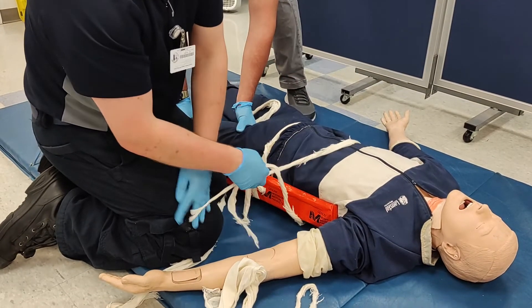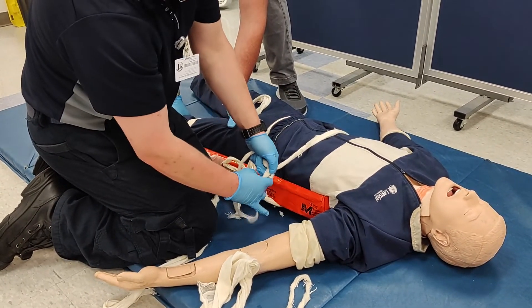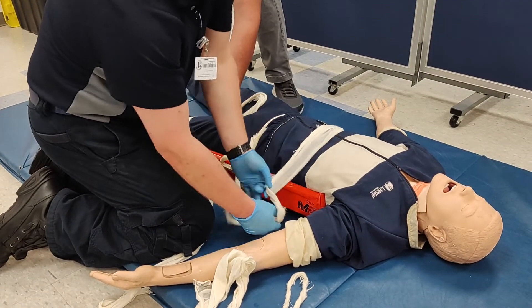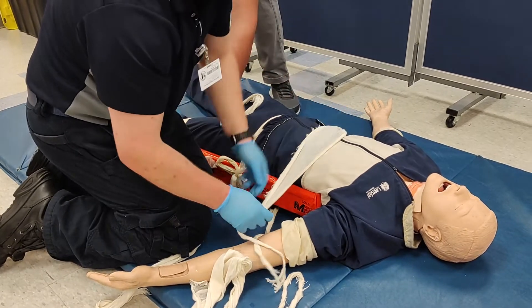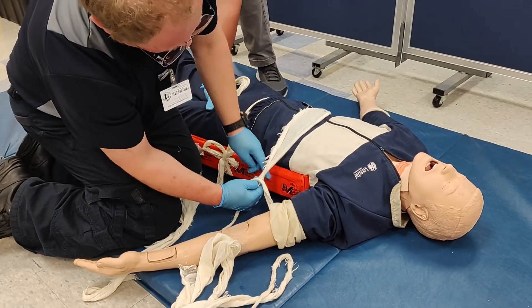As you tie the top cravat, do your best to spread out the cravat so it doesn't apply too much pressure over too small an area, and coordinate with your patient as they breathe in so you do not over-tighten it and restrict breathing.